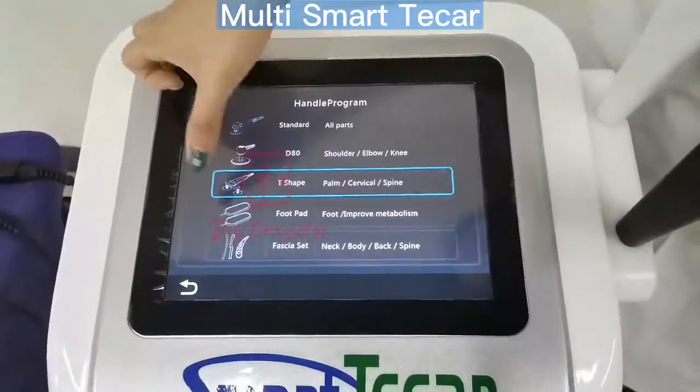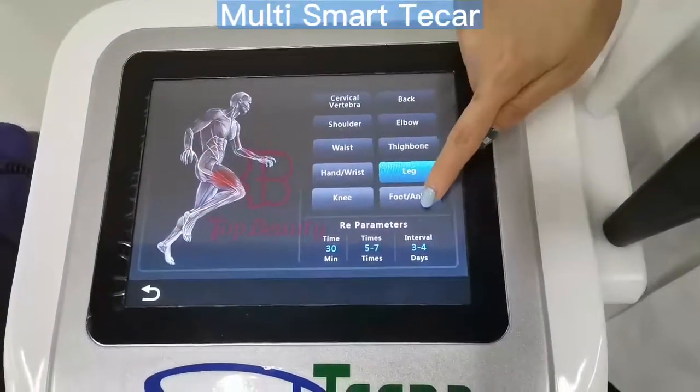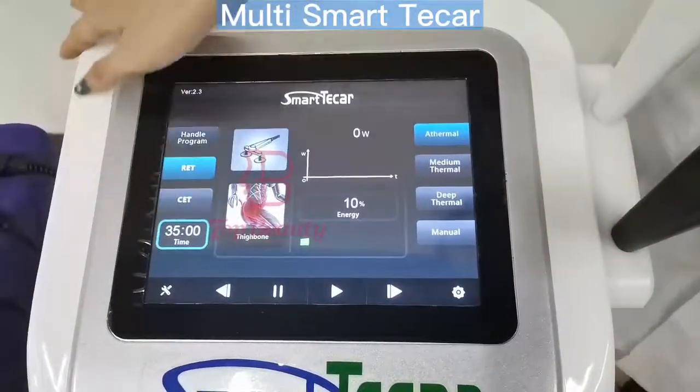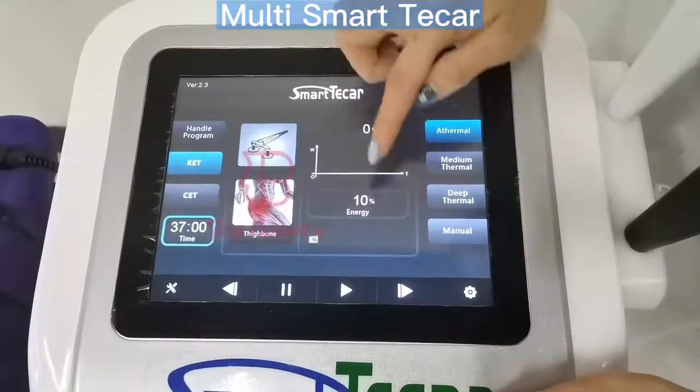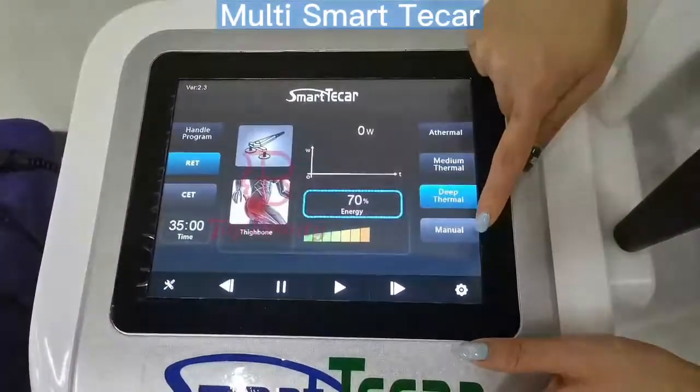Next is the T-shape handle — 10 treatment areas, working time setting, and energy setting.